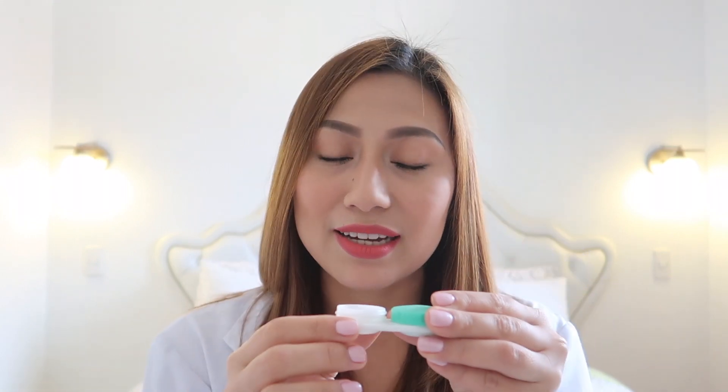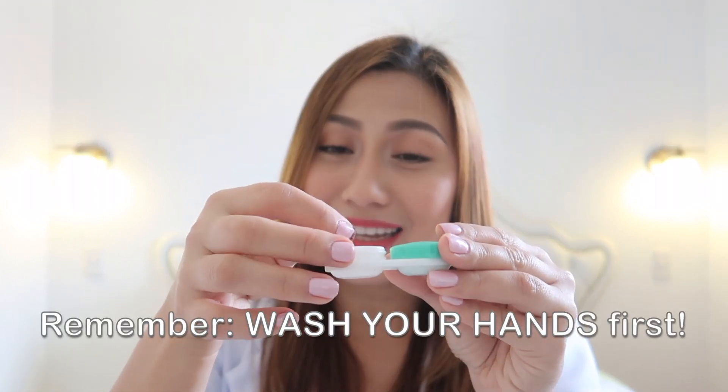But actually there is an easier way for you to know if your contact lens is in the right position. It's very easy and you don't need one or two minutes to figure it out. I have here the contact lens case and the contact lens inside. First, remember to wash your hands before taking the contact lens out of its storage case.